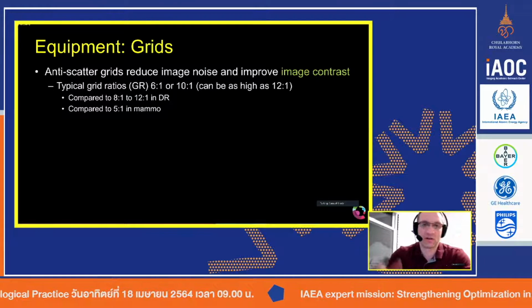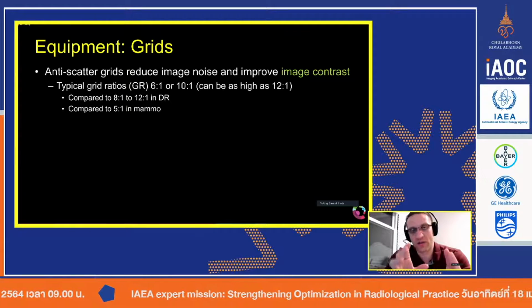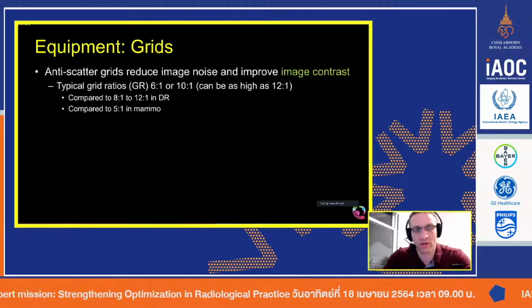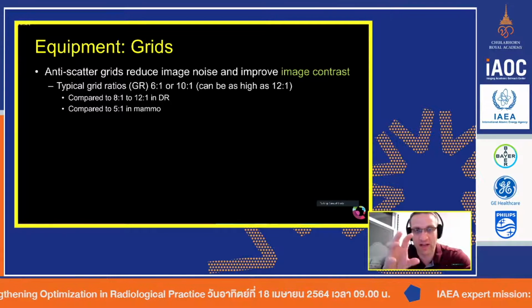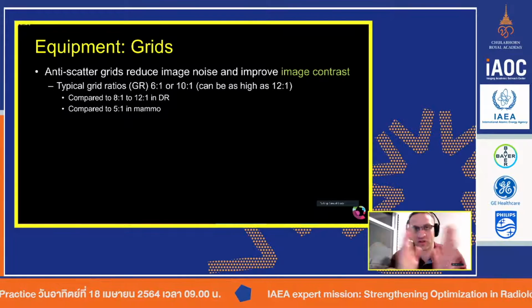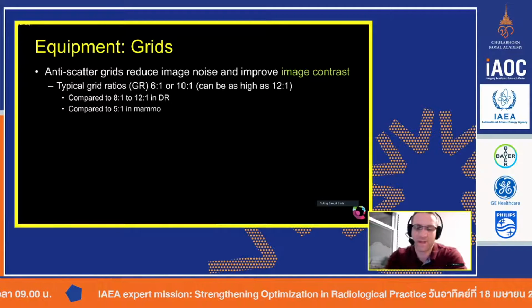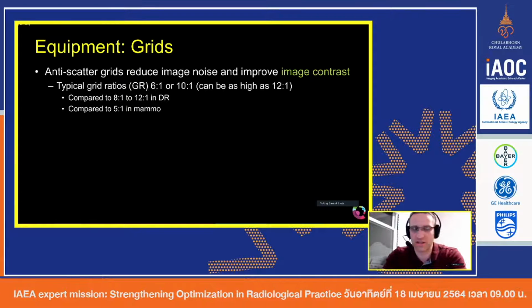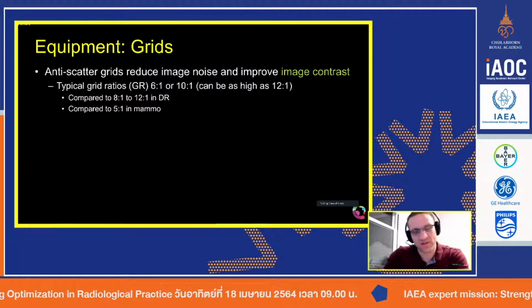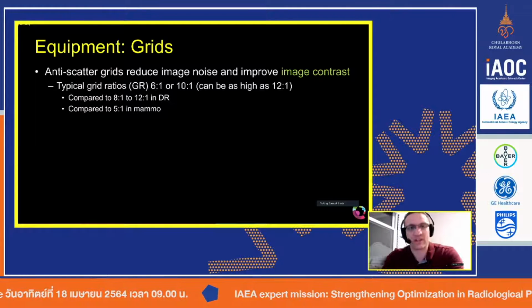All right, so collimation is usually step one. You get things collimated, you get the anatomy nice and localized. Now you've greatly enhanced your chance for good image quality, because you're looking at the anatomy, you're getting rid of the extraneous scatter that would come in, and you're reducing your dynamic range so that the system can produce a good quality image with the right amount of grayscale. So those are just very basic, good quality steps as technologists know and use as they're operating the system. For those of you radiologists that are very hands-on and like to manipulate the system, step one is to get a good collimation.